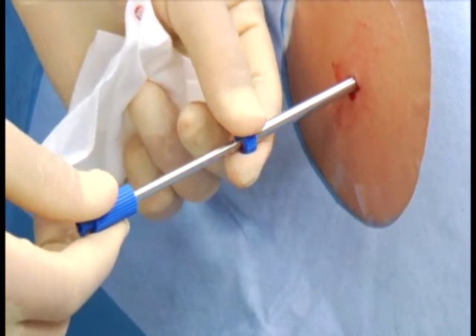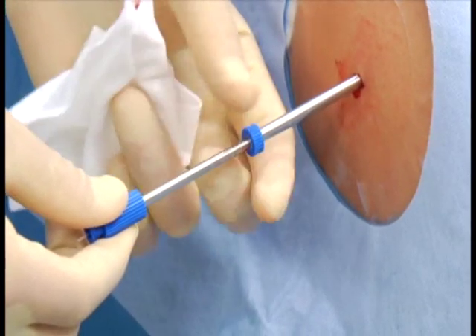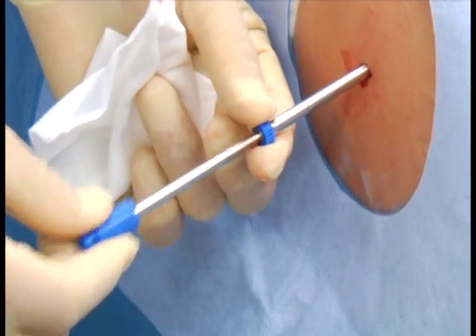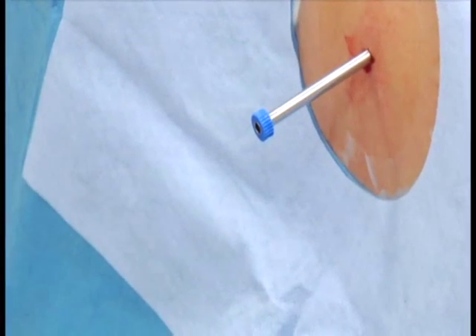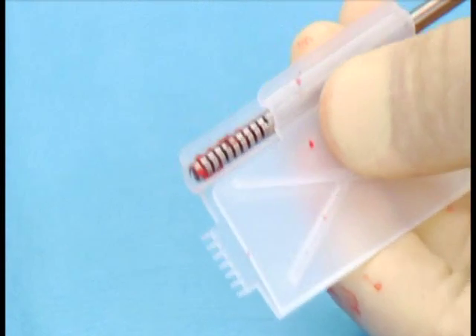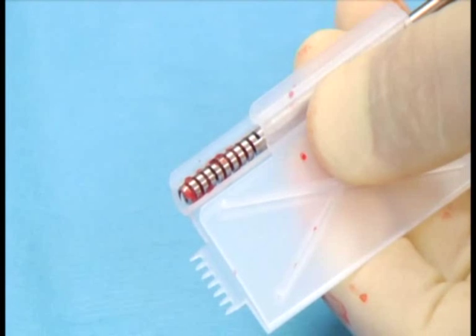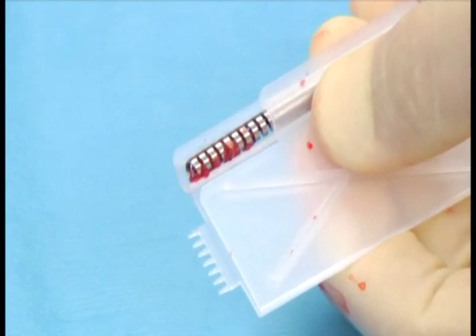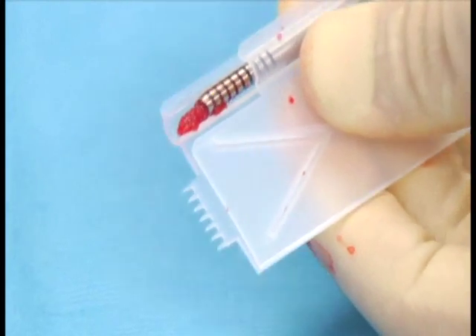When completeness of the cutting is felt, the receiving needle can be removed for release of the sample. Note, the cannula can be left in place for additional samples. The helix is positioned over the teeth of the releasing element, and the releasing element is folded and closed over the receiving needle. To free the sample, rotate the helix counterclockwise.